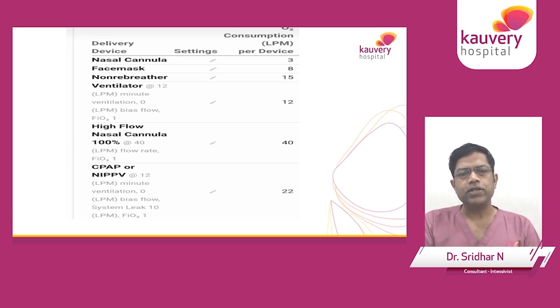But how do we work out how much oxygen is being consumed on the ventilator, on the high flow nasal cannula, or CPAP devices? On the ventilator, we need to look at a couple of things. The minute ventilation of the patient determines how much oxygen is being consumed. So somebody who is on the ventilator receiving a minute ventilation of about 12 liters per minute is consuming that much, then at an FiO2 of 1, which is in other words 100% oxygen, they're consuming 12 liters per minute.